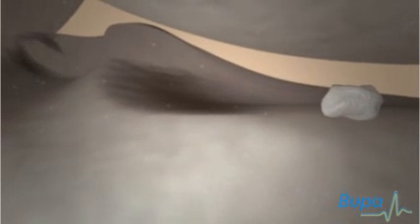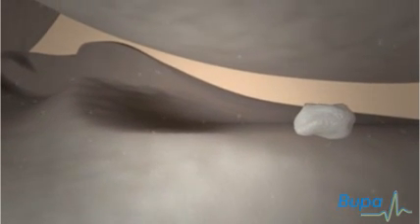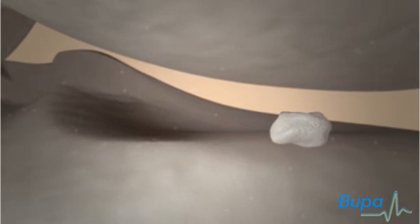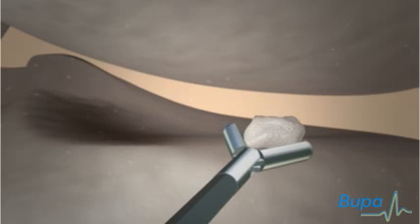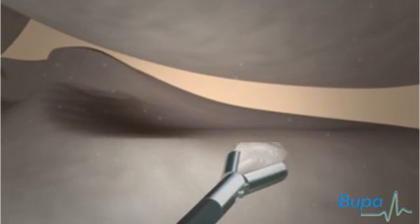Your surgeon will look inside your knee joint to see if there is any damage. Your surgeon may pass instruments through the third incision to repair damage, or remove material that interferes with movement or causes pain in the knee. Your surgeon may also remove tissue if it's affecting the movement of your knee.